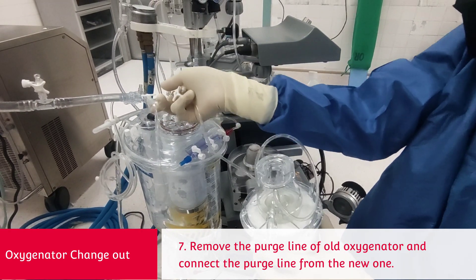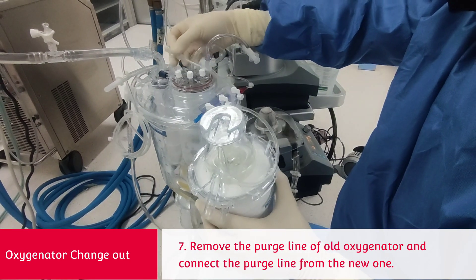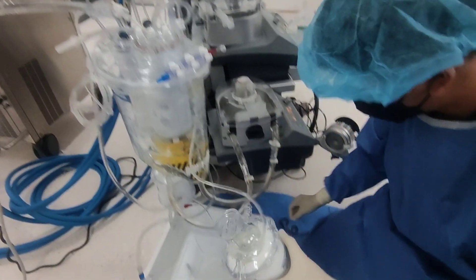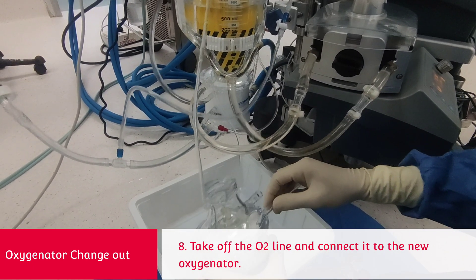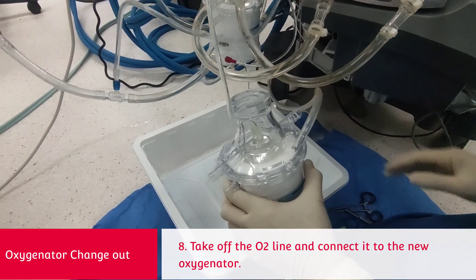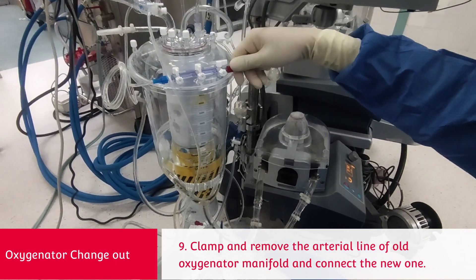Disconnect the purge line of the old oxygenator and connect the purge line from the new one. Disconnect the oxygen line and transfer it to the new oxygenator. Clamp and remove the arterial side of the manifold from the reservoir and connect the new oxygenator's arterial side of the manifold.